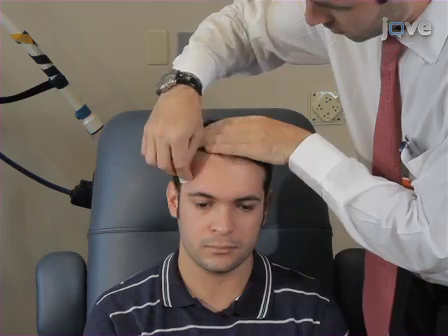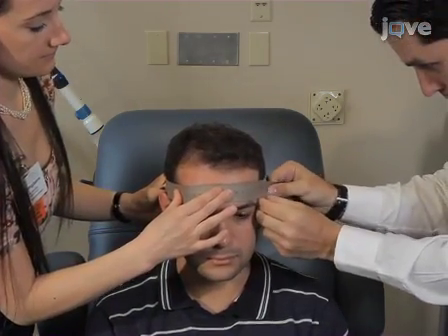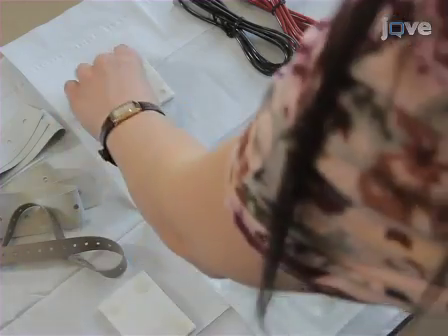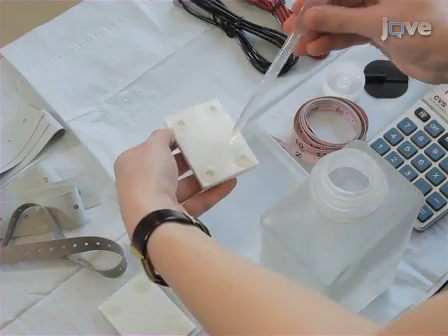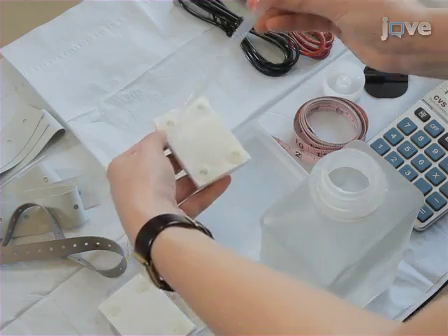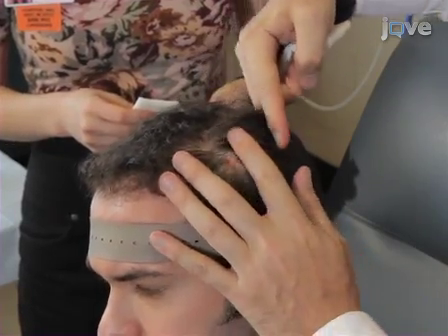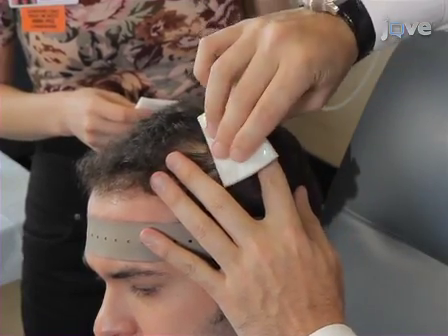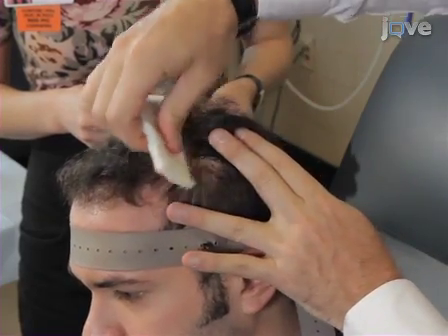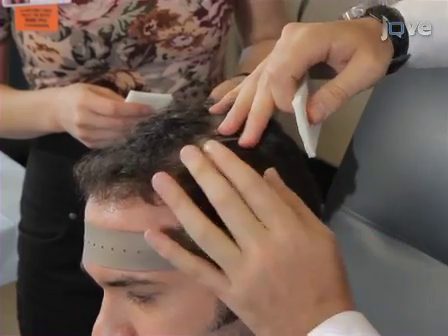Before placing the electrodes, place an elastic or rubber head strap around the subject's head under the inion. This will serve to secure the electrodes and reduce movement during stimulation. Next, prepare the sponges by saturating each side with saline solution. For a 35 cm square sponge, approximately 6 ml of solution per side should suffice. Inspect the skin where electrodes will be placed for signs of irritation. In case of any visible lesions, do not apply tDCS in this area. To increase conductance, move hair away from the electrode sites, clean the surface of the skin, and allow it to dry.